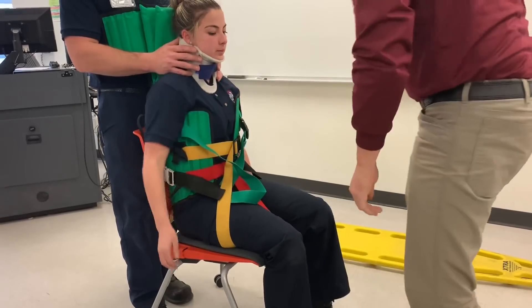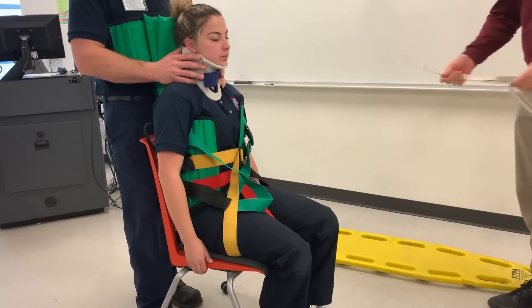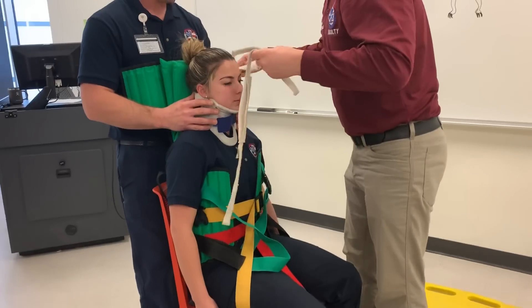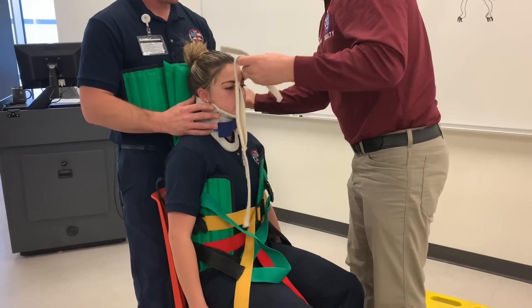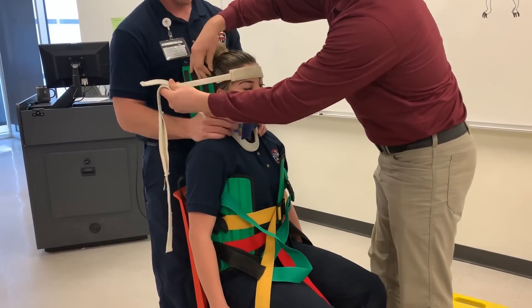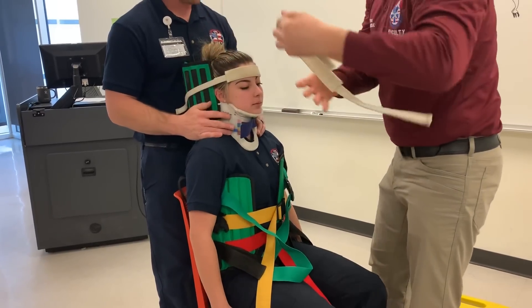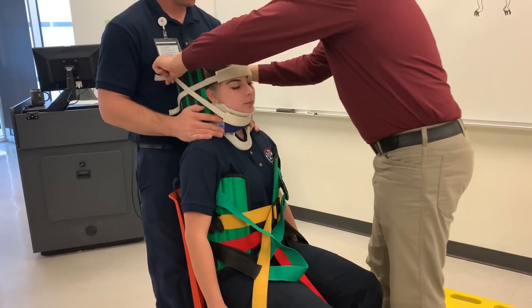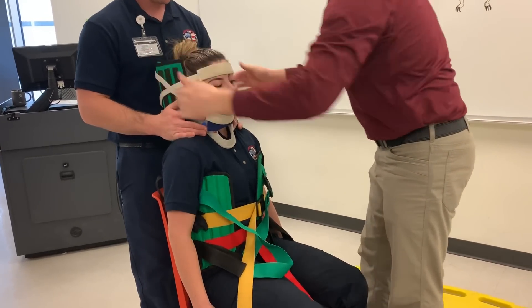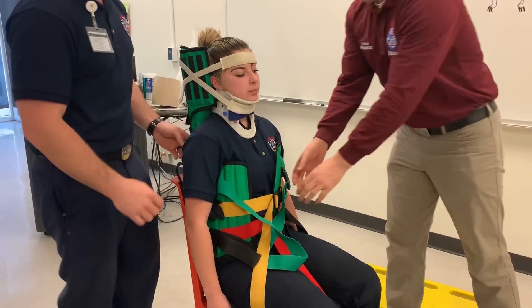Securing the head. Partner is now relieved of holding C-spine.